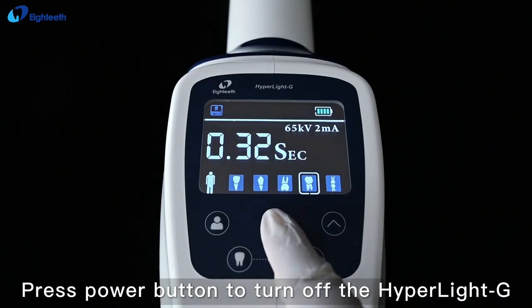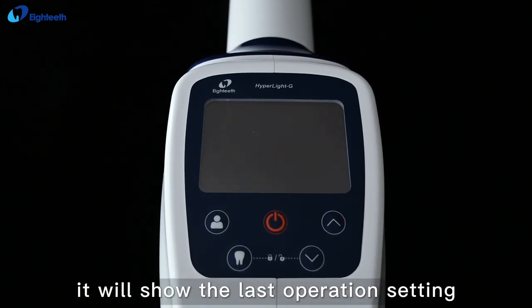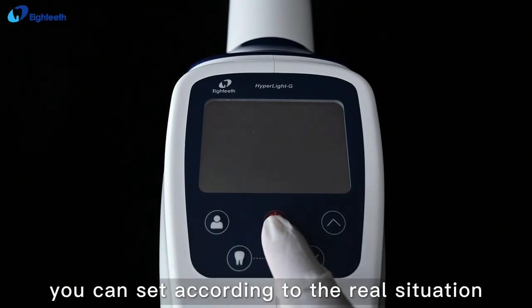Press the Power button to turn off the Hyperlite G. When you turn it on next time, it will show the last operation setting, and you can adjust according to the real situation.